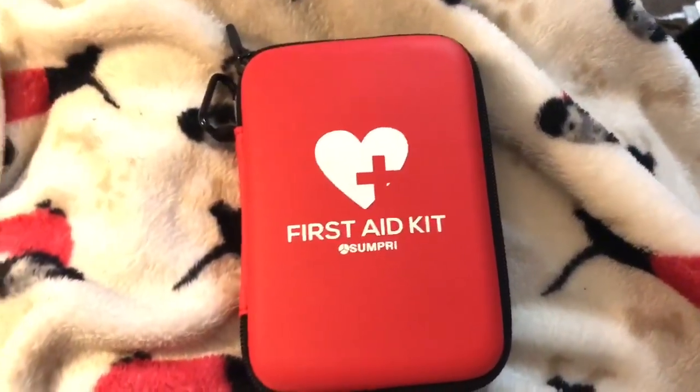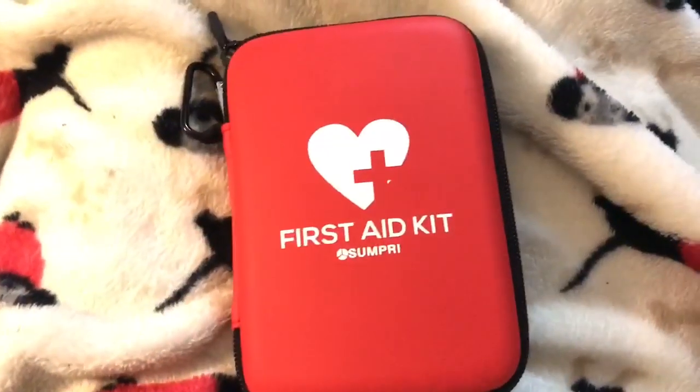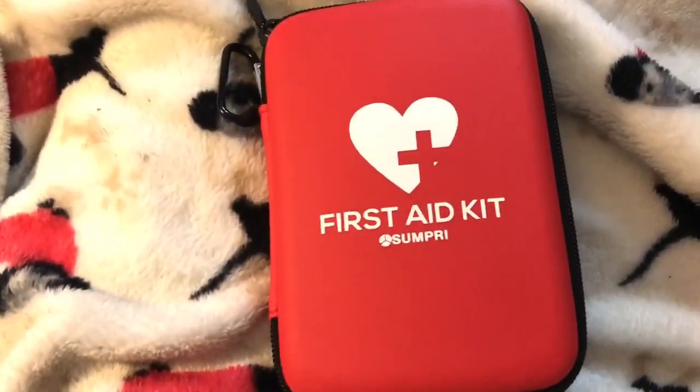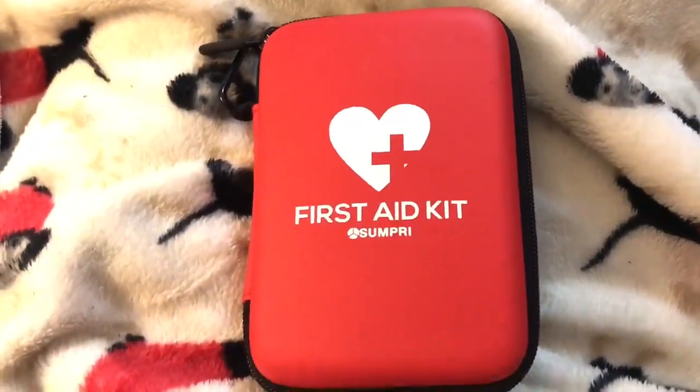Alright guys, this is a great little first aid kit. I got this to keep in my car because I'm walking and exercising, and I don't really have any kind of first aid kit in the car. I'm going to all these parks and stuff, so I need to have something.